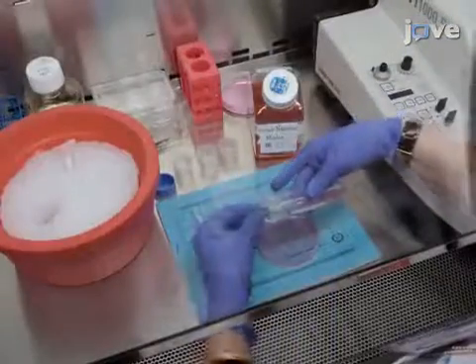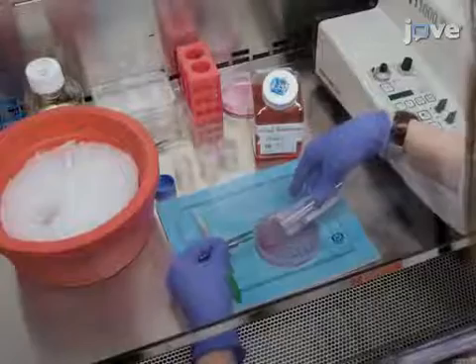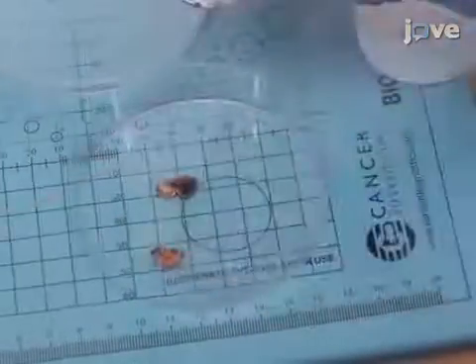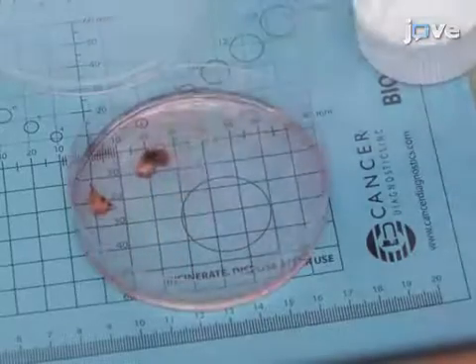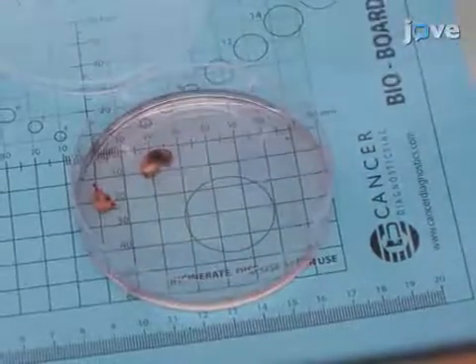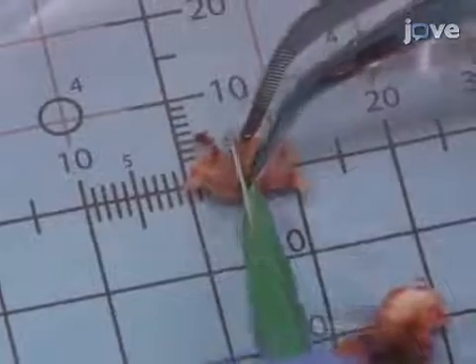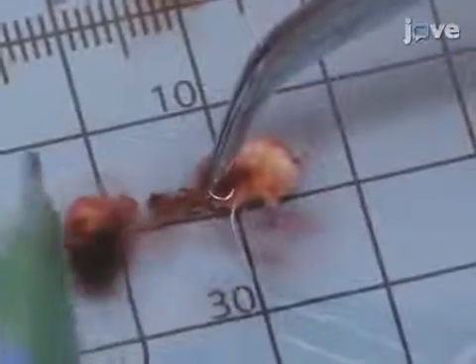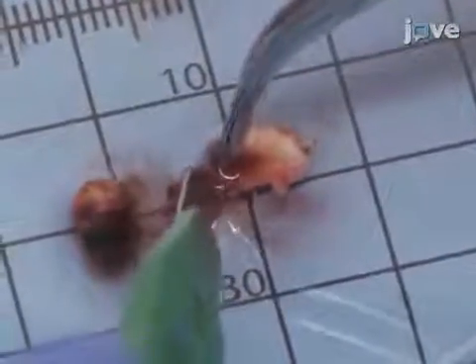Next, place the tumor tissue pieces in a petri dish containing ice-cold processing medium and use a pipette to gently wash the tissue three times with fresh medium to remove any adherent red blood cells. After the third wash, use a scalpel to cut the tumor pieces into approximately 3x3x10mm strips, carefully removing any attached vessels and avoiding necrotic or cauterized tissue.